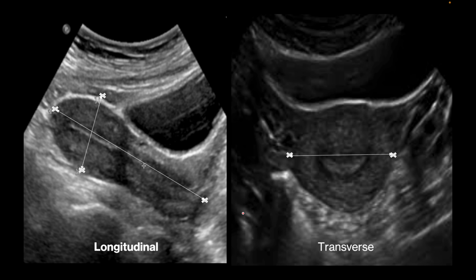Now this is the mid-sagittal view of the uterus and this is the transverse view of the uterus. We take length and height in the mid-sagittal image, while we take width in the transverse. Uterine length is measured from the outer serosal surface of the fundus to the external cervical os. Here in this image you can see this is the outermost part of the uterine fundus and here is the external cervical os. So we take length from fundus to the external cervical os. So this is the length.